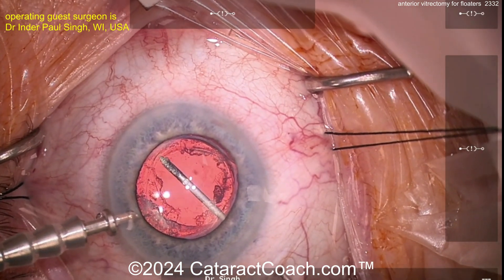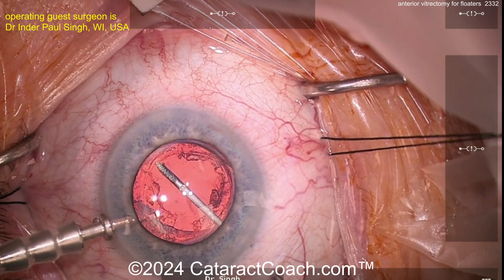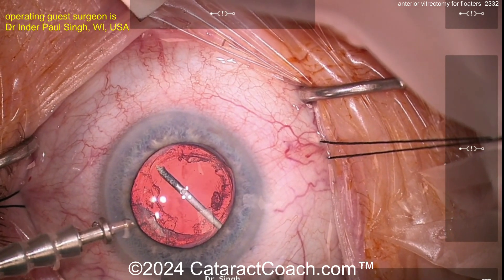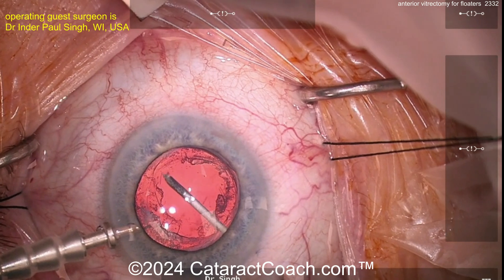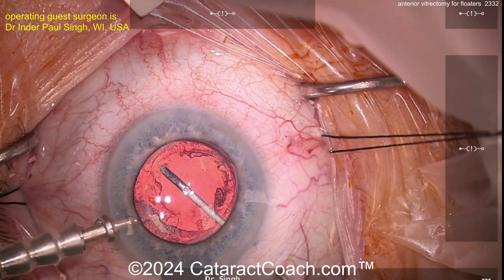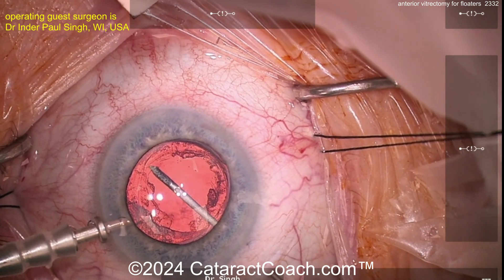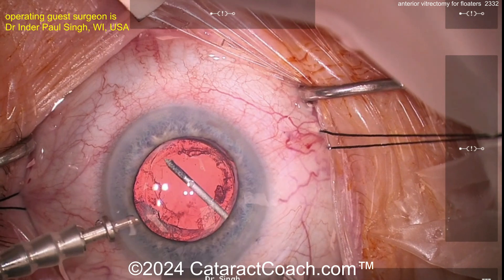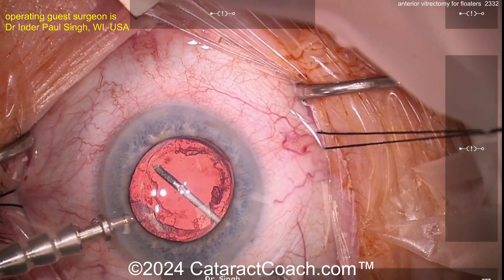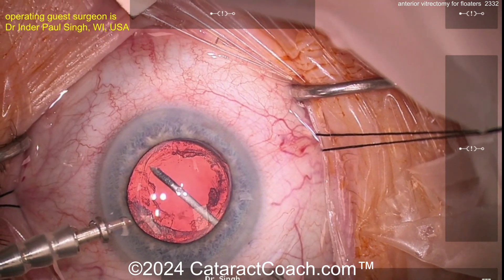I'm using very low vacuum — we're talking 40, 60, 80 or so. We're not using high amounts. The idea is that with low vacuum, we're only removing whatever is liquefied; we're not trying to pull and tug the vitreous skirt that's attached to the retina. We want to leave that alone. So we're doing basically a core vitrectomy, only removing the vitreous that's liquefied. You can see pieces come to you with very low vacuum — it's a dual-blade cutter.